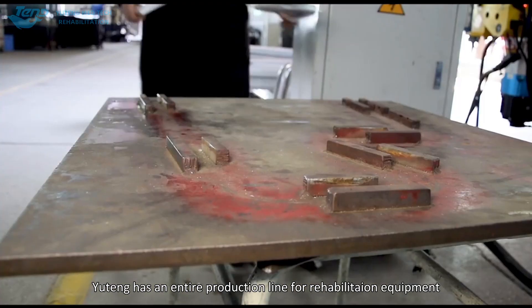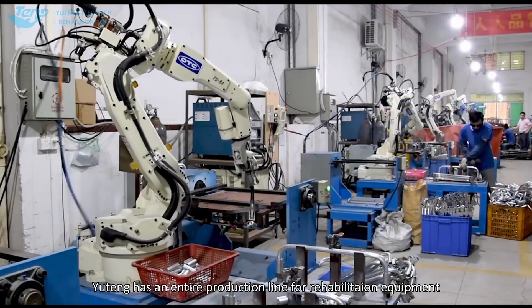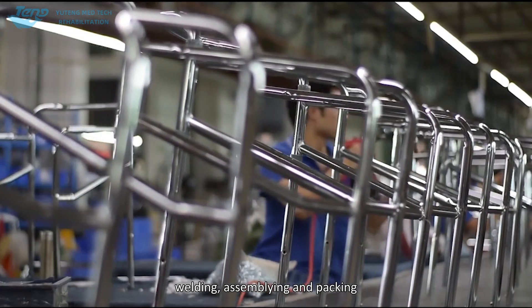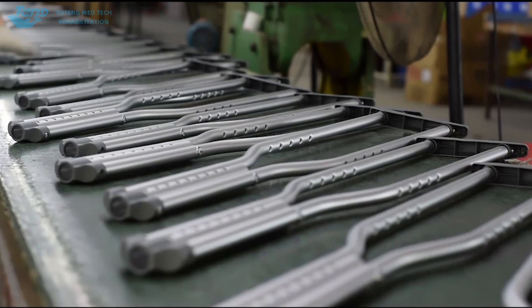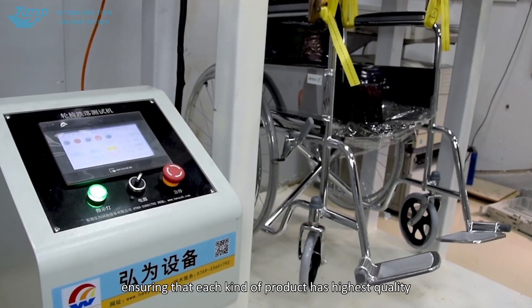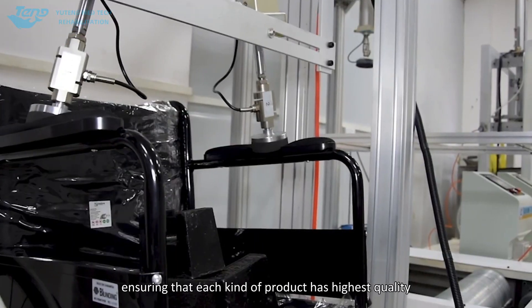Uding has an entire production line for rehabilitation equipment, including modeling, bending, welding, assembling, and packing. We also have a quality testing process, ensuring that each kind of product has the highest quality.